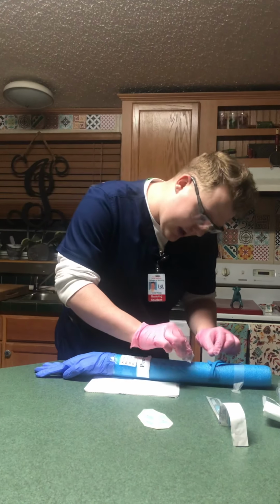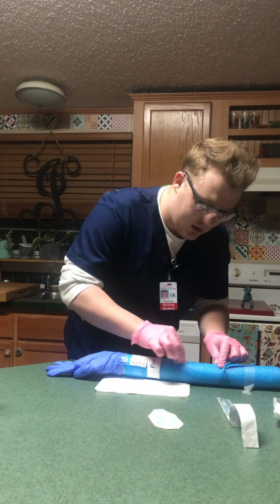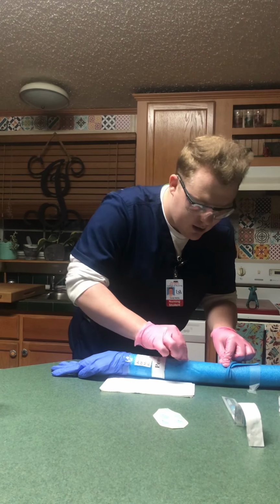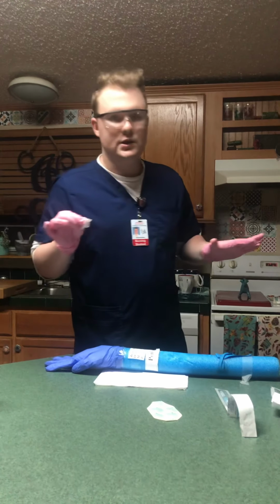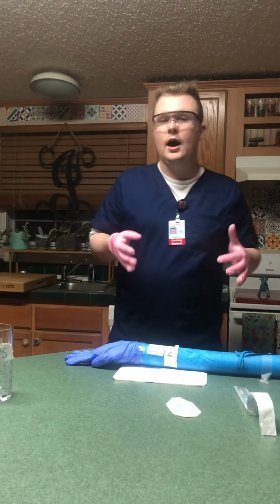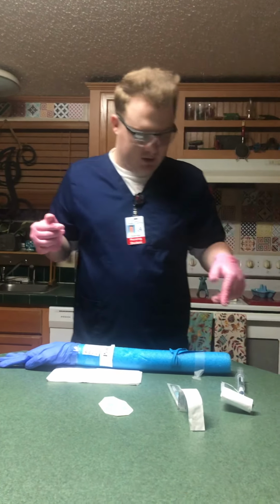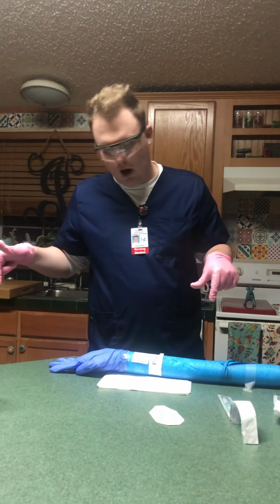So I'm going to get the site that I've selected and scrub with friction. I'm going to scrub horizontally, vertically, and in circular motions. And I'm going to state that I would do it for 30 seconds. I dispose of this in the trash. Let it air dry and then don't touch it. So my saline lock is already close nearby. I have my Tegaderm nearby as well with all of my tape.